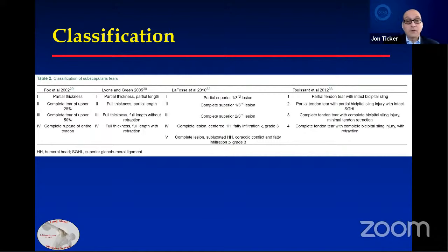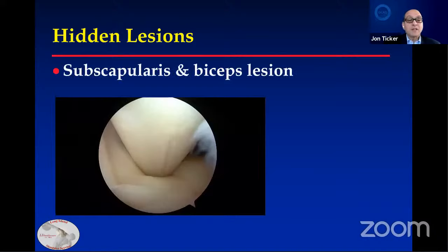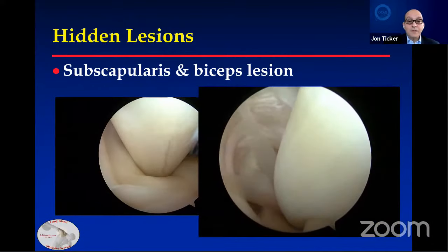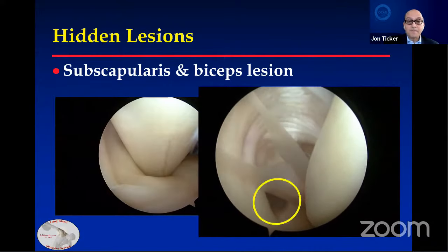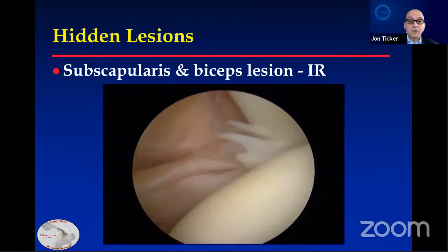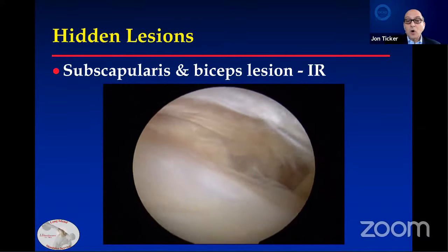Hidden lesions are important to identify. Looking at the biceps tendon into the groove — to the left is the subscapularis. You can see a little fraying under the biceps, which we would typically leave alone. But as you go down into the groove, anterior to the biceps tendon, you're going to see a small defect — the so-called hidden lesion. This is a very small one, but I can't imagine it's going to get smaller; it's only going to get larger. Here's another case where there's a seemingly innocent split in the subscapularis, but if you internally rotate and look through that split more laterally, you're going to see the biceps tendon — this requires treatment as well.